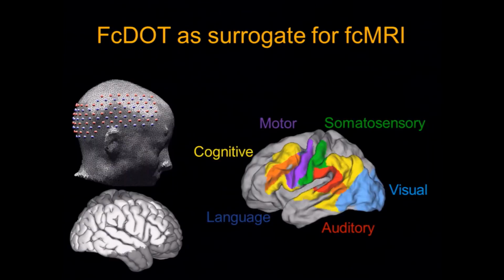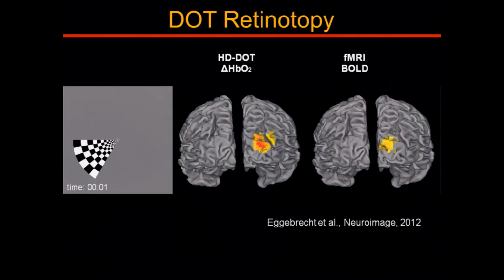So this is kind of just to go back to this. With small animals, you can validate by doing things like cryoslicing, which means when the mouse is done, you just kill it and slice it up. For human neuroimaging, you don't really have that type of situation. You have to find another way to validate.